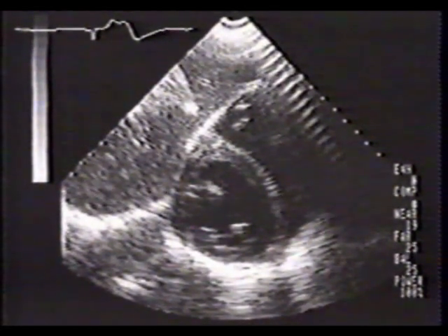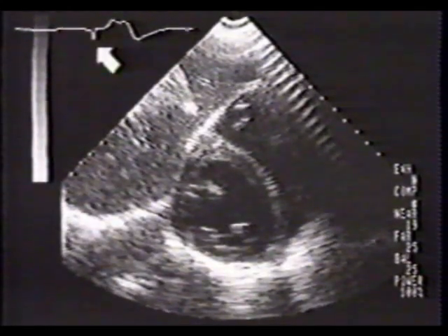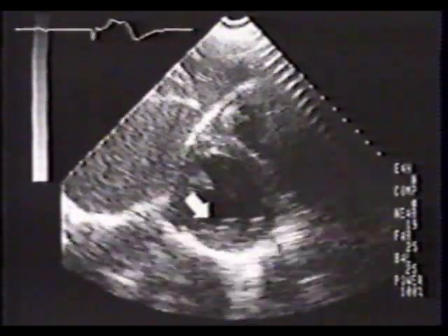This is a subcostal view with the patient being ventilated. Compressions are being held. The rhythm is paced. A temporary pacemaker was inserted earlier in the resuscitation effort. At this time, there is still a slight amount of contractility of the anterior and lateral walls.